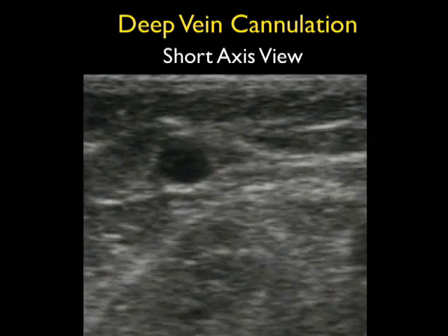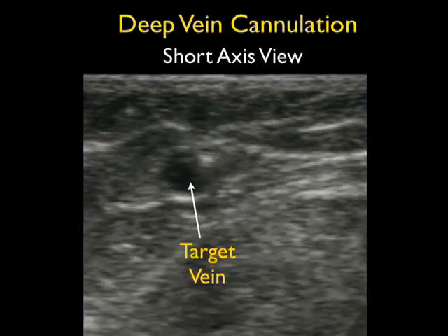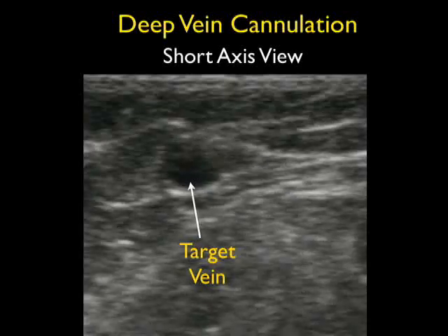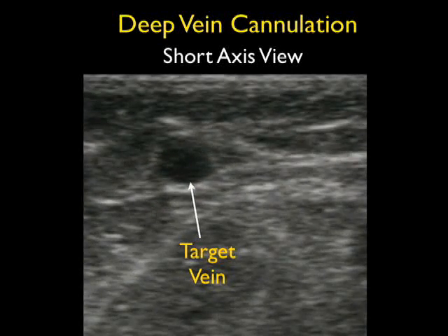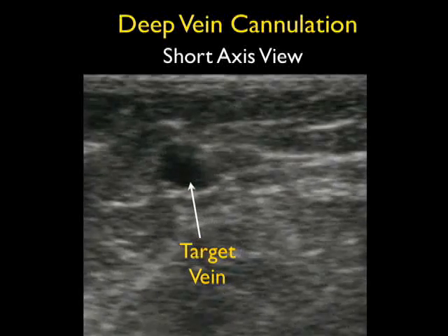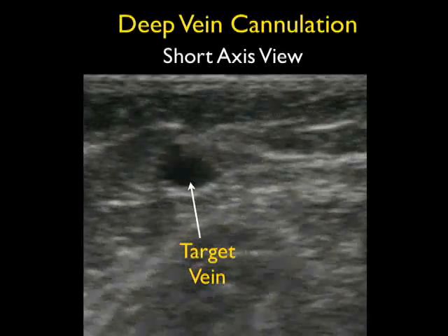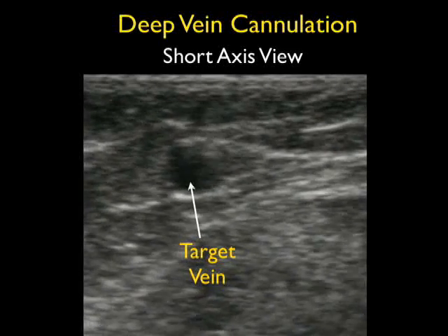Now let's take a look at some video from a real cannulation attempt on an ED patient. Notice the target vessel in the middle of the image, and we can see the echogenic tip of the needle coming from the surface, permeating the anterior wall of the target vein, and then the echogenic needle tip seen within the lumen of the vessel. At that point we would usually have flash of blood within the angiocath, and then we could thread the plastic part of the catheter within the target vessel.